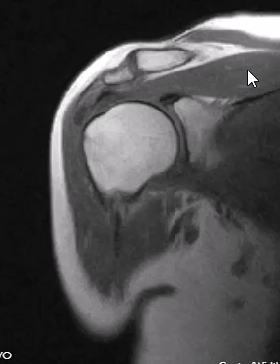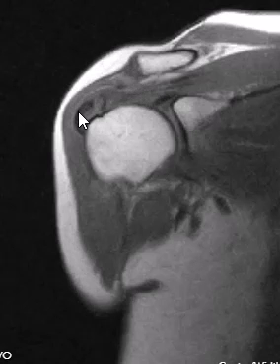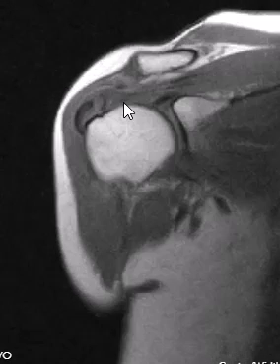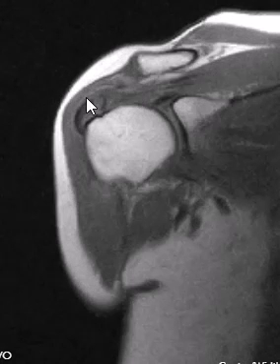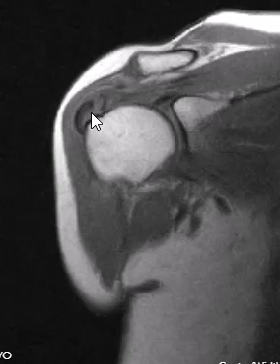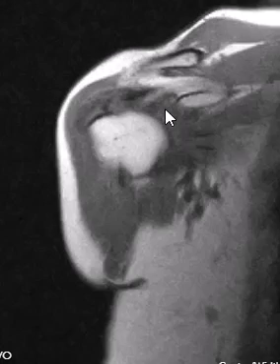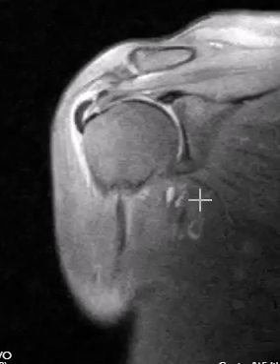We can see the supraspinatus muscle here coming horizontally across. Her problem is right here at the supraspinatus tendon insertion. We see the supraspinatus tendon is expanded, kind of bizarre looking, and we see these arcs of low signal within it. This is a classic example of calcific tendonitis, and it really shows up better on this next image.